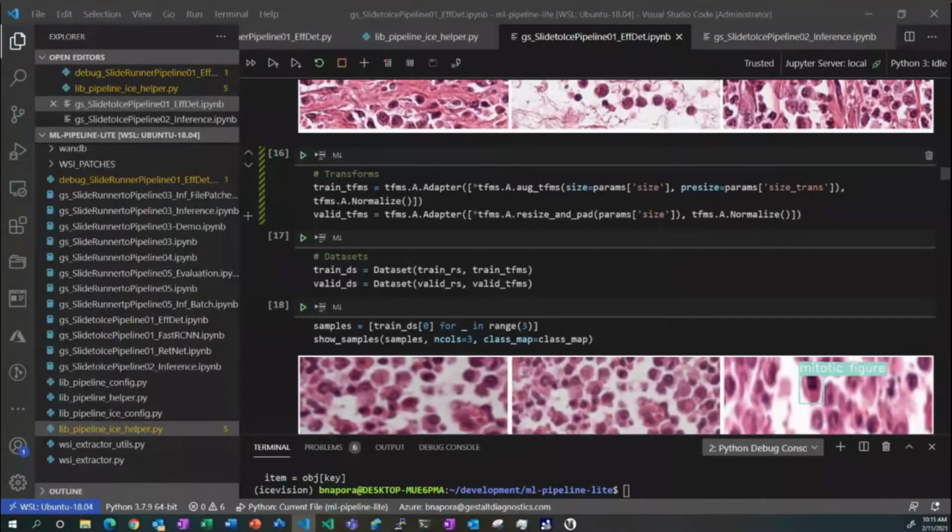I haven't done that in a few weeks, but maybe you're talking about the shape of the image that you transform those patches to, like the 512. Because the anchor boxes are fixed, that's the configuration of the model. But the bounding boxes or your targets, that's the size of the mitotic cells. Yeah, if I'm recalling correctly.